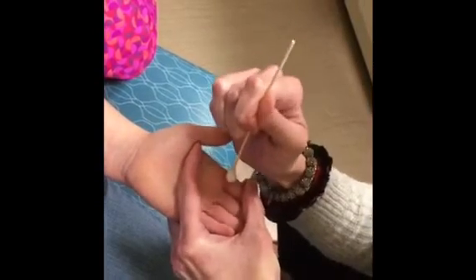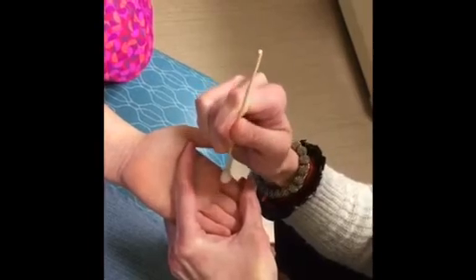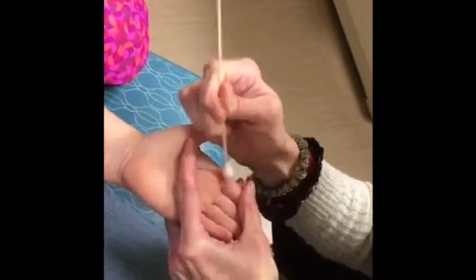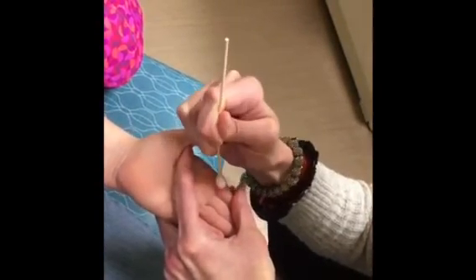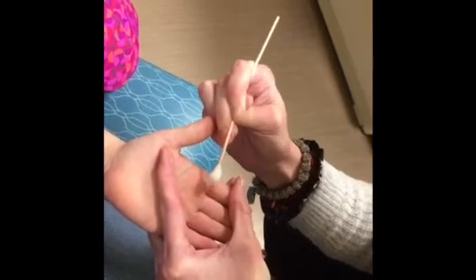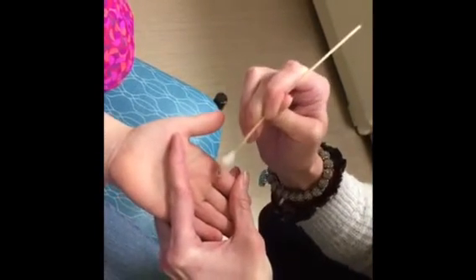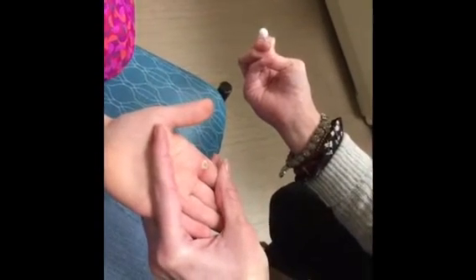This might hurt the worst. You okay? Good job. And get all around the borders. Okay, I'm going to do a little bit more because it is so elevated. Okay. You are so tough. Looks pretty good.